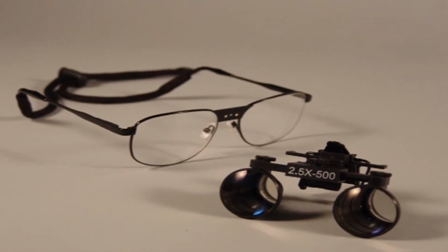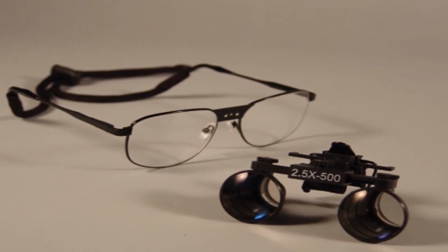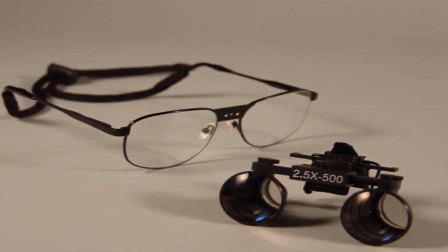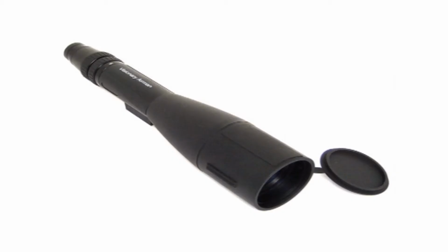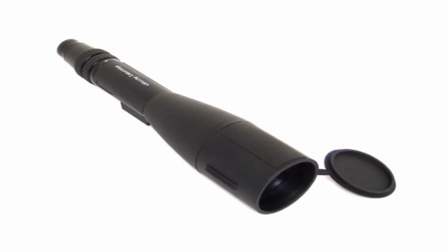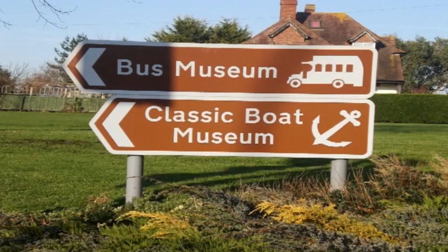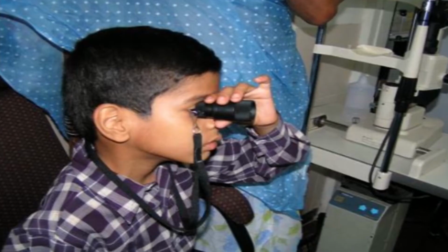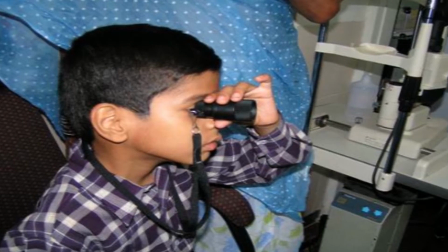The clip-on telescope allows the user to clip the telescope over the glass for hands-free use, and it can be used for extended periods of time. Handheld telescope is a monocular type of telescope and provides a quick view of distant objects. It is useful for spotting purpose like reading the sign or name board. The disadvantage is that the patient has to hold the telescope in their hand, so it is difficult to use for the children.